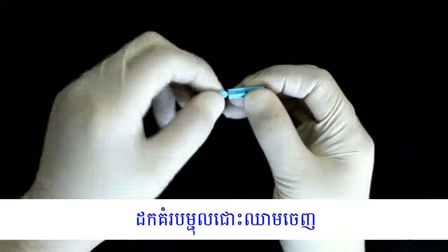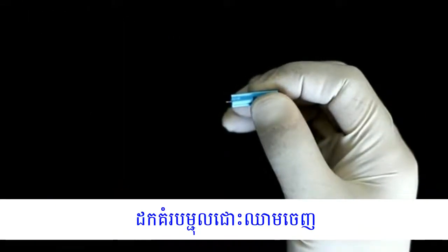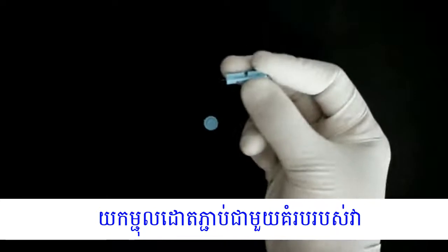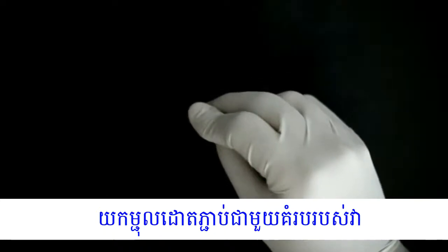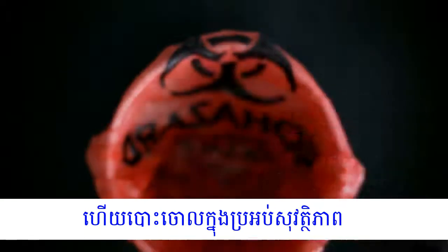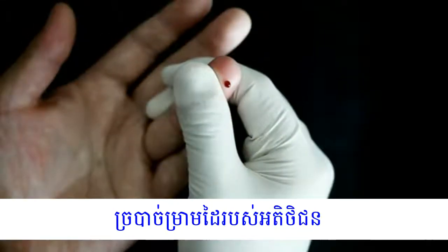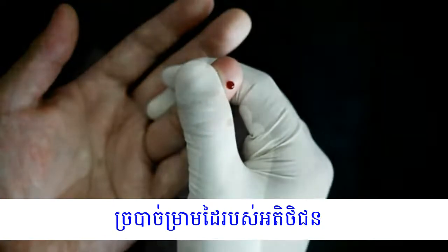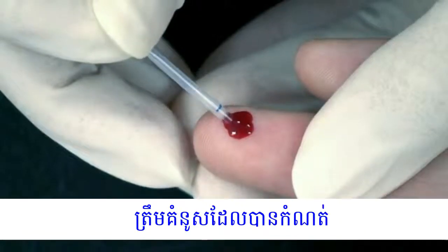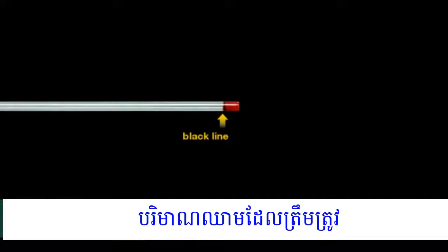Twist off the protective cap of the lancet. Squeeze the end of the fingertip and pierce with the lancet provided. Discard the lancet immediately after pricking the finger. As the blood bubbles up, collect blood to the black line of the 20 µL capillary pipette. The amount of blood collected is critical — this is the correct amount; too little is insufficient.